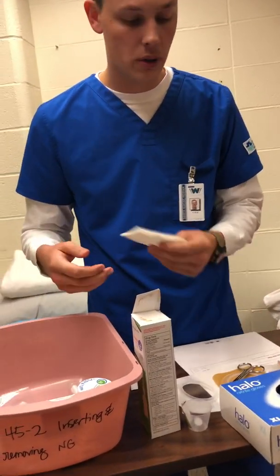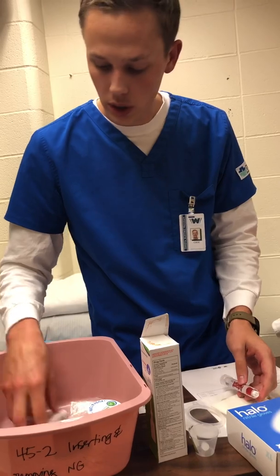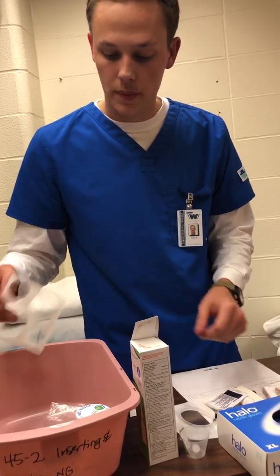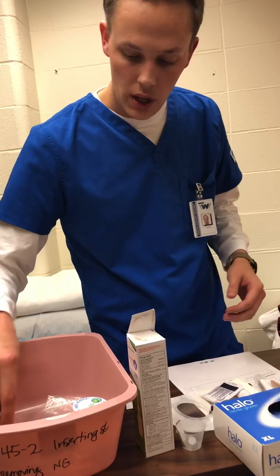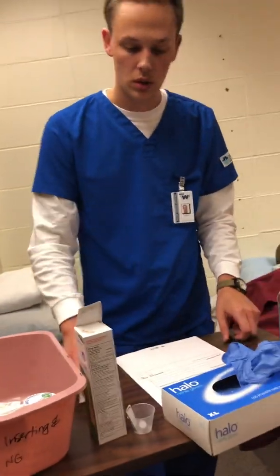I'll be needing a 4x4 gauze. I'll be needing the ostomy paste, as well as the ostomy powder, some adhesive remover, and a stoma sizer. And so with all of those supplies handy, I'll be able to enter the patient's room.